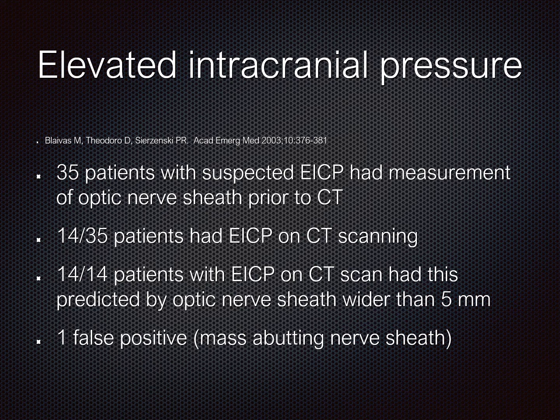In order to do that, you need a bolt or a direct intracranial pressure monitor, and that needs to be placed by neurosurgery. Neurosurgeons are not available everywhere, and they are not available immediately in the emergency department in most places. So when they did this study and realized that there were ultrasonographic findings that correlated with patients who had increased intracranial pressure, it was very exciting. This was a very useful thing to have, especially in austere locations, where you are more likely to have an ultrasound machine than a neurosurgeon.